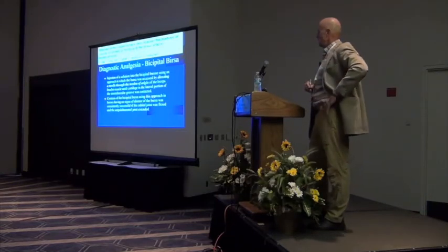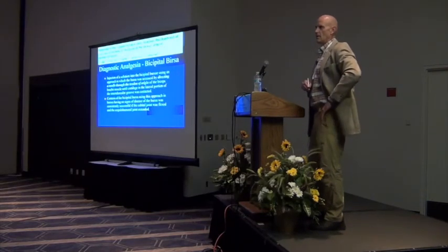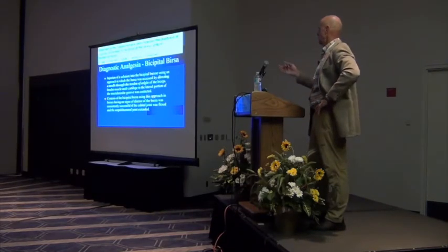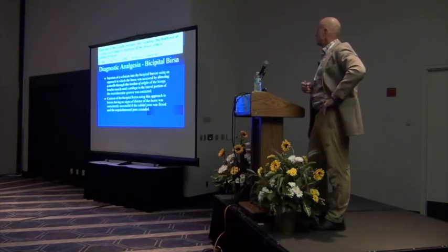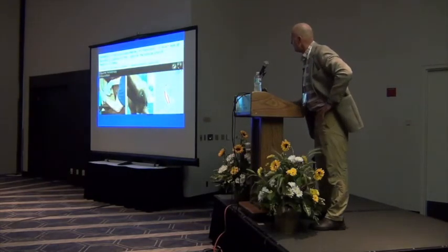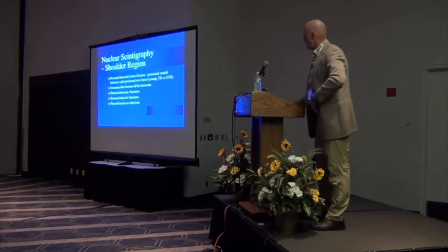So in my old age, I have come to embrace, above all else, do no harm. And if I can ultrasound guide a stick and prevent trauma to a tendinous structure, I would prefer to do that. But that is an option if you're not comfortable doing an ultrasound guided injection. And that just kind of shows them how they're doing it. Interesting. And this is just kind of showing how we get in there.